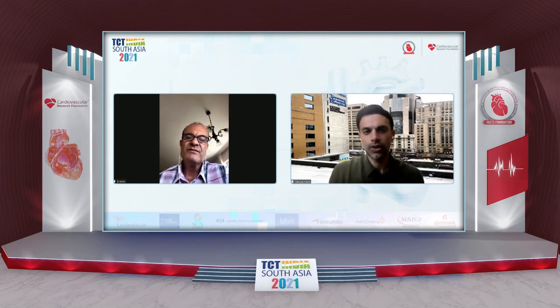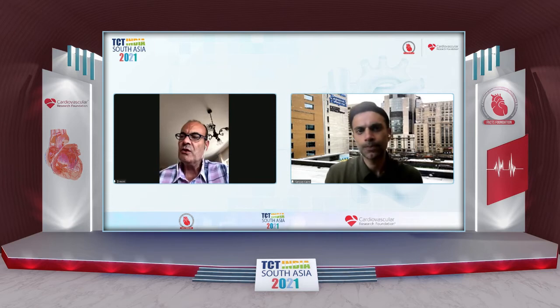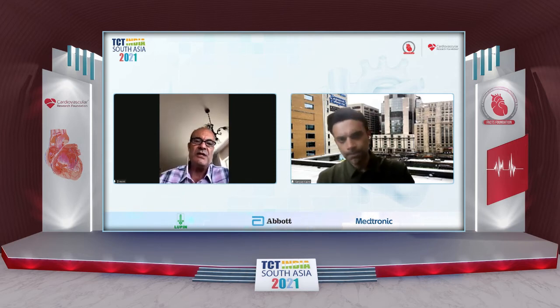The only ones I don't do it in are the ones where the patient's too sick or we're doing something else or I can't get the darn device down. And that's the minority. I couldn't agree more. And it's also beyond safety and success, but also durability of the procedure. So I personally use 100% intravascular imaging in my cases.